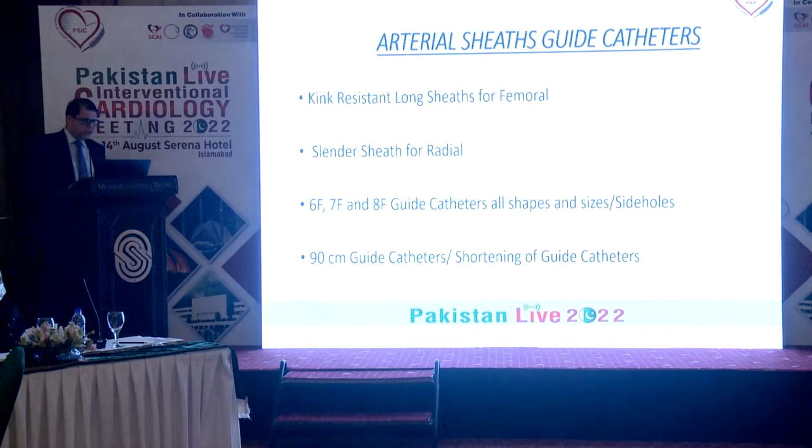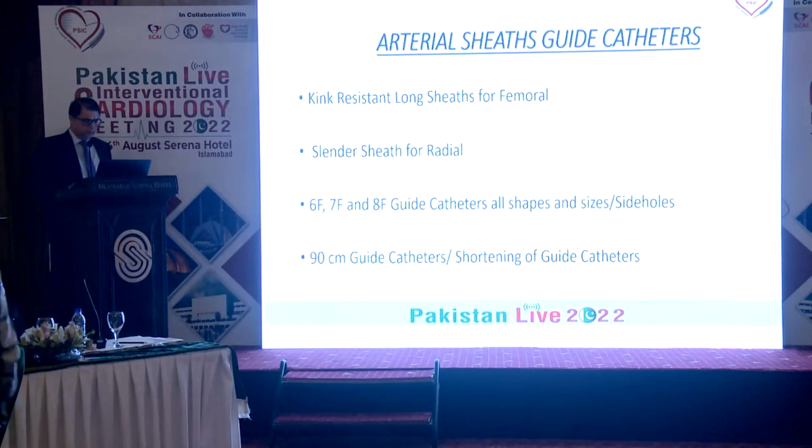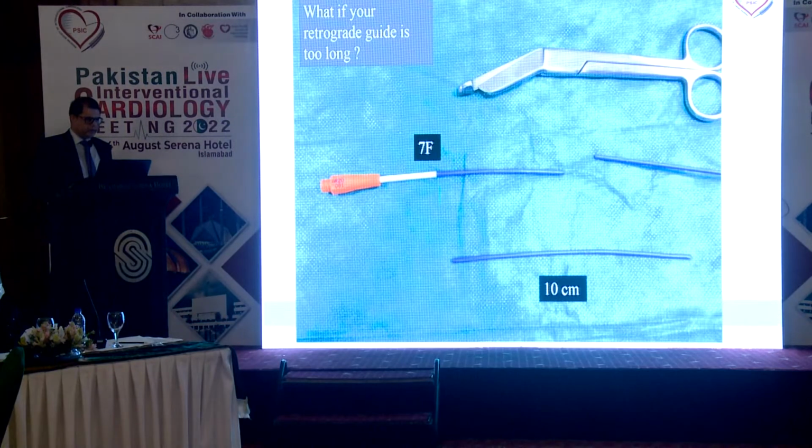Now, another important thing is that your guide catheters need to be short for the retrograde approach. You can find 90 centimeter guide catheters from different companies, but sometimes they are not available here, so you need to shorten the guide catheter. And this is how you shorten it.